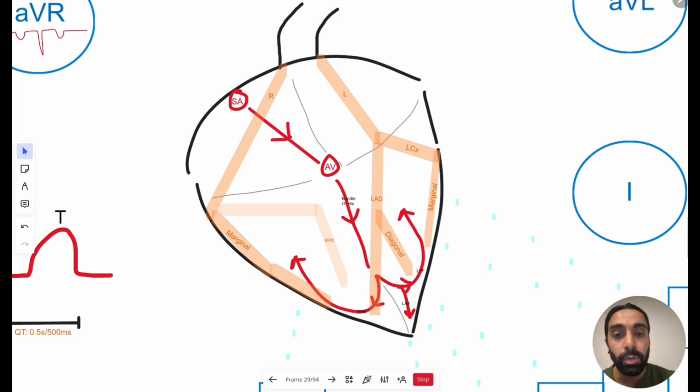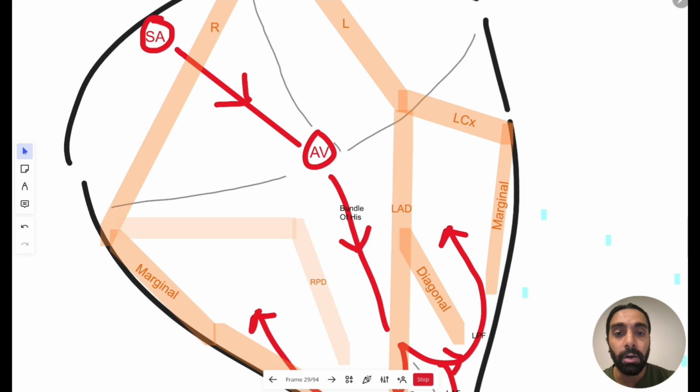So if you have AV nodal reentry tachycardia, where there's this constant loop of depolarization that's happening within the AV node, and some of it gets depolarized and causes these QRS amplitude signals. Some of them also go backwards into the atria, and that's why you see a P wave after a QRS. So remember that rule we were talking about, P waves before QRSs.